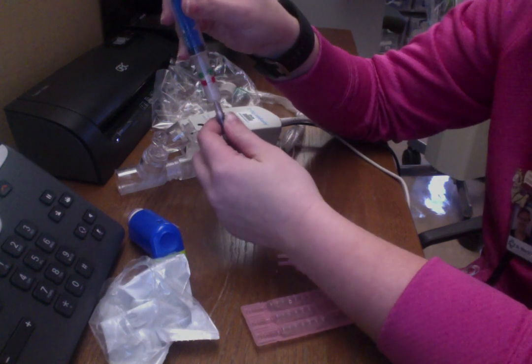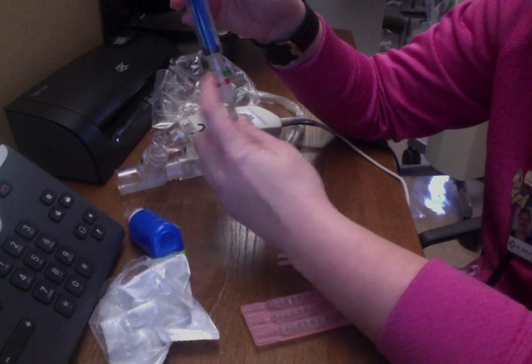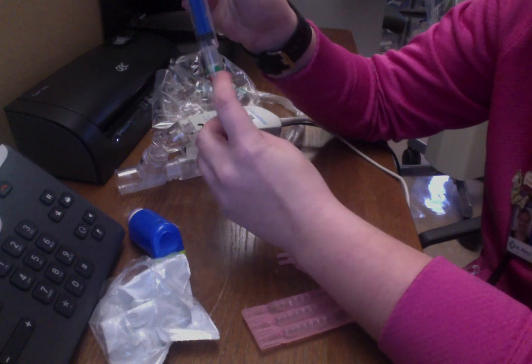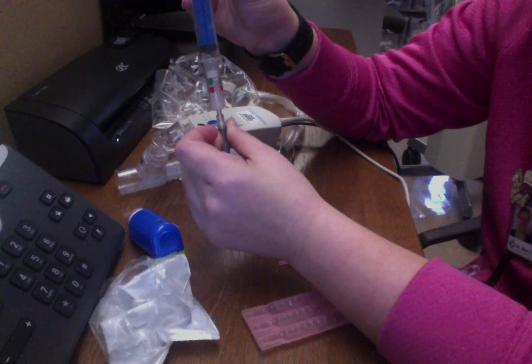This little float will kind of go between the green and the red. If I push this all the way down, then I've inflated it too much and it's now into the red. I can take some air out of it until I'm back into the green, and that tells me that my cuff has a good pressure.